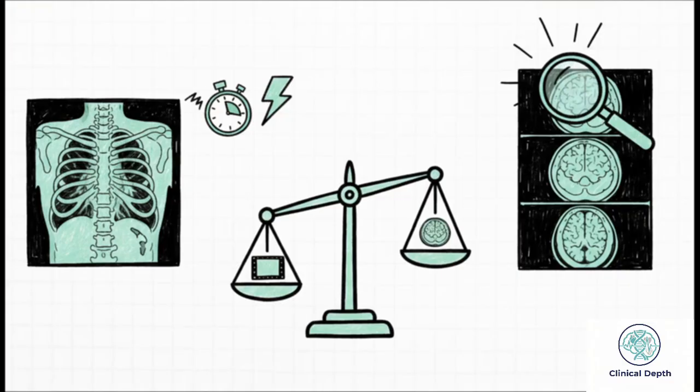Okay, let's break it down one last time. An X-ray is your fast, efficient 2D snapshot. It's perfect for that first look. The CT scan is your 3D detective, the one you bring in when the mystery is deep and every single detail matters. But the most important thing to remember is that neither one is better than the other. It's always, always about your doctor choosing the right tool to get the clearest possible answer for you.